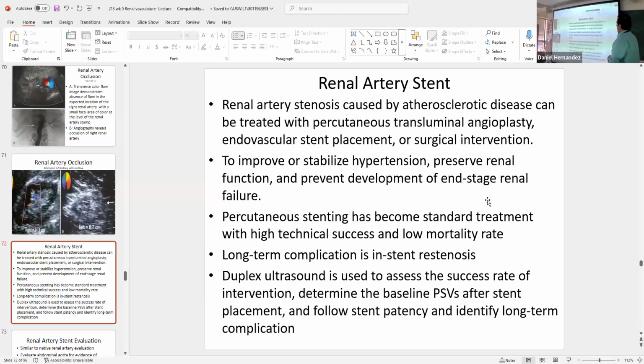Renal artery stents. So renal artery stenosis, again, is typically caused by atherosclerotic buildup within the proximal portion of that main renal artery. So we can go in there with percutaneous transluminal angioplasty. We can do our balloon angioplasty, open up the vessel, place a stent now to keep that vessel open. So you can place a nice medicated stent in there. And that patient's going to have significant, tremendous improvement of the renal function now.